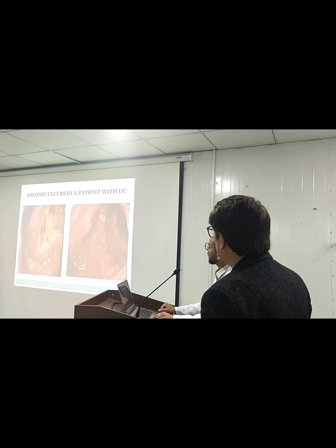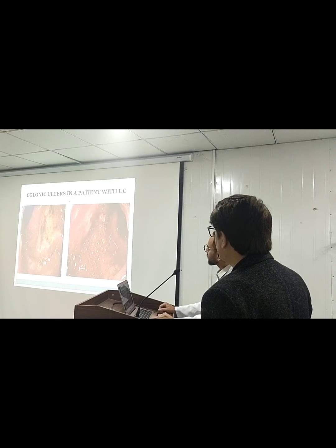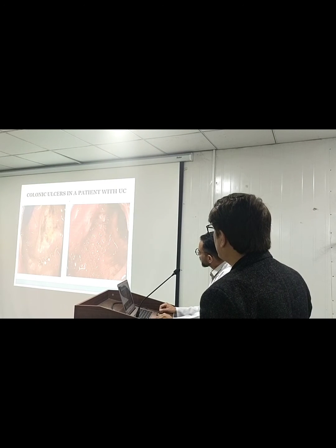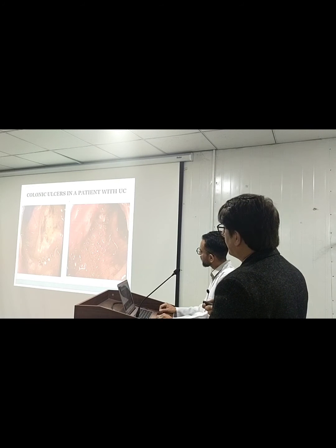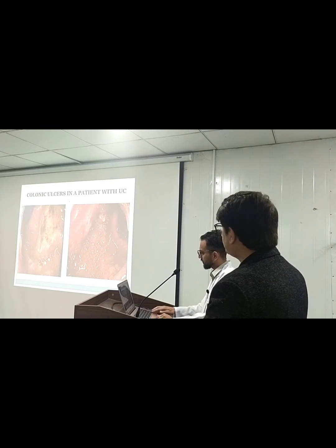Colonic ulcers in a patient with ulcerative colitis. This was a 45-year-old male patient who presented with PR bleed and melena. This was the picture of the whole colon, which was almost ulcerated up to the splenic flexure. Initially we thought it might be an infective cause, or ulcerative colitis, or, very rarely, Crohn's, but later on his biopsy was done, which turned out, unfortunately, to be ulcerative colitis. So the patient is on treatment now.